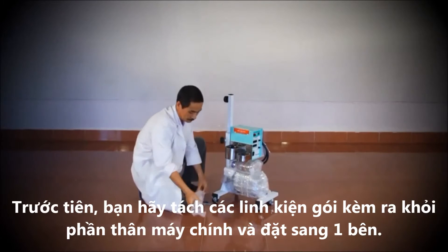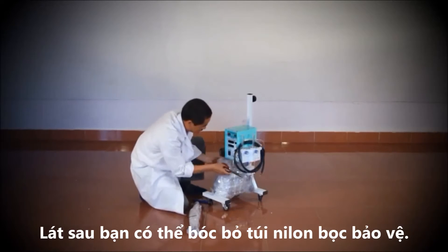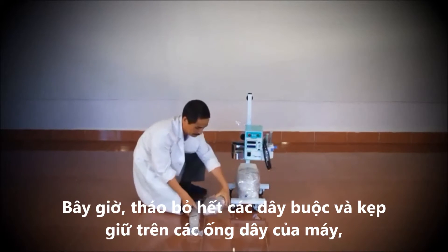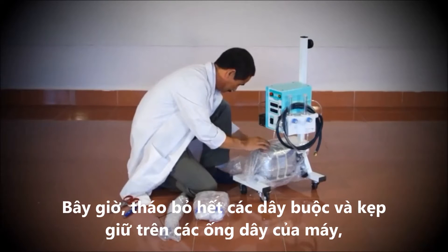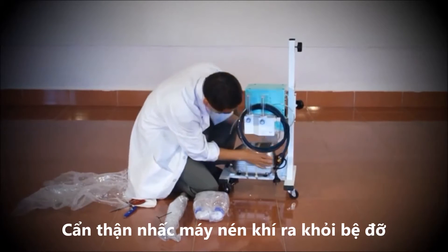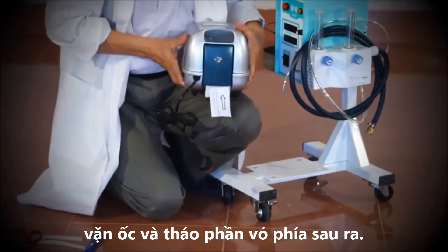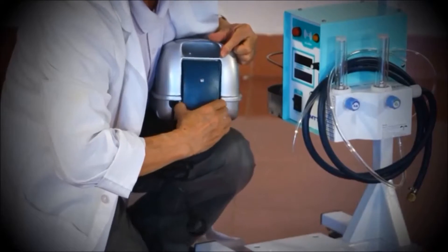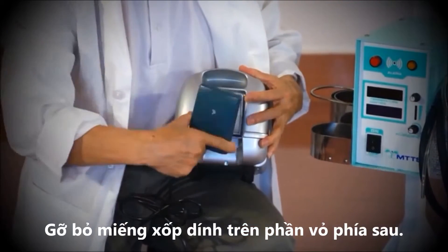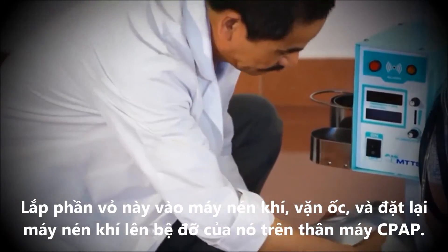Begin by unpacking the components attached to the CPAP main unit and place them to one side. You can remove the bubble wrap later. Now remove all the straps and clamps holding the wires and tubes, as well as the bubble wrap protecting the air compressor. Carefully take the air compressor off its stand on the machine and unscrew and remove the back panel. Remove the styrofoam from the back panel and discard.